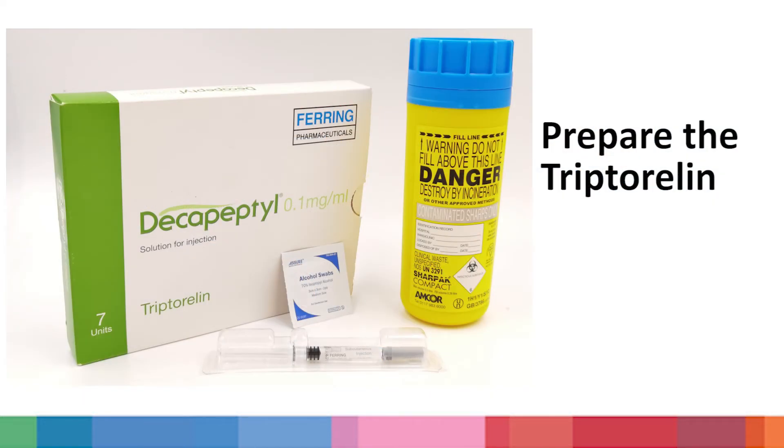Next, prepare the following items: one pre-filled tryptorelin injection, one piece of alcohol swab, and one container for disposing the injection, such as a disposable plastic bottle.